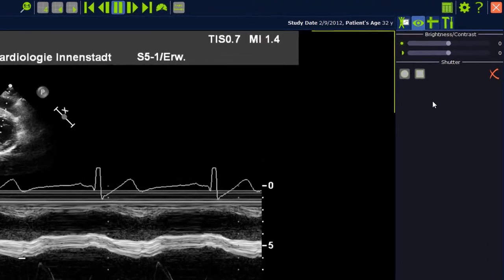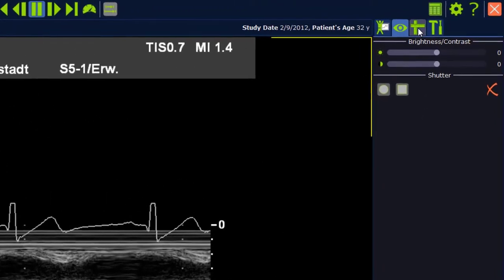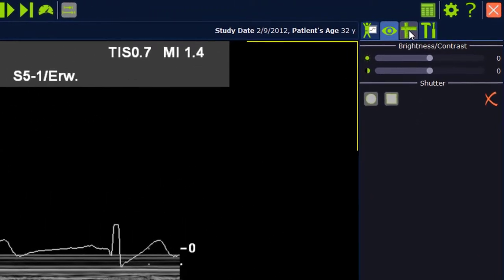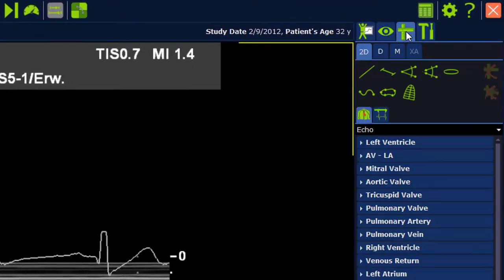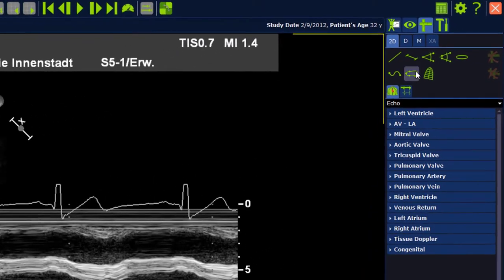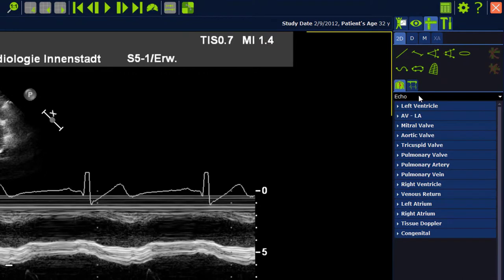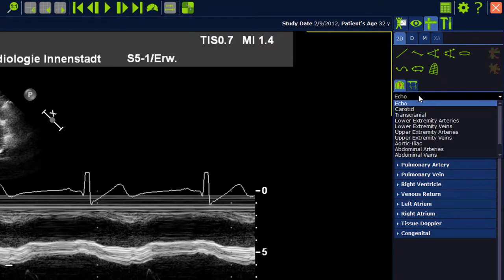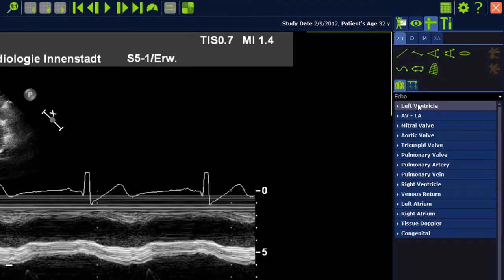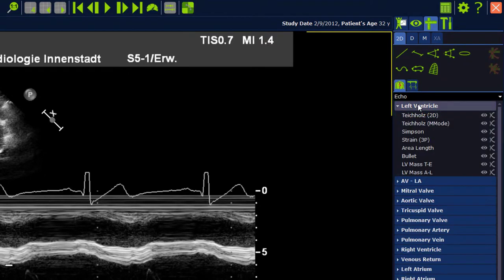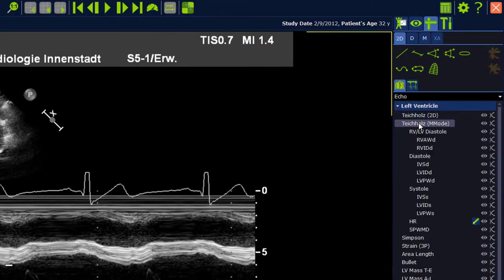To perform measurements, switch to the measurement tab in the upper right-hand corner. Select the exam type Echo, select the group Left Ventricle, followed by the package Teichholz-M-Mode.